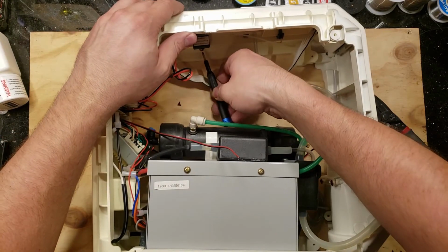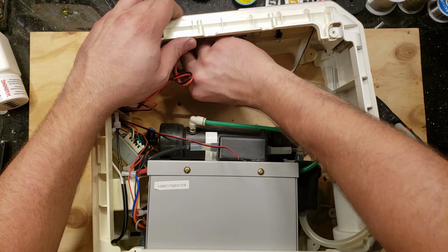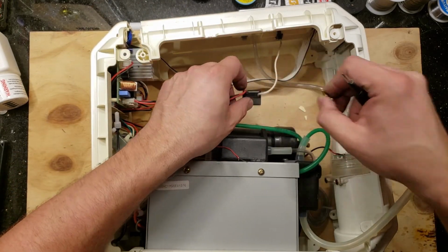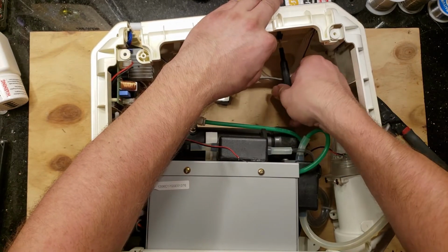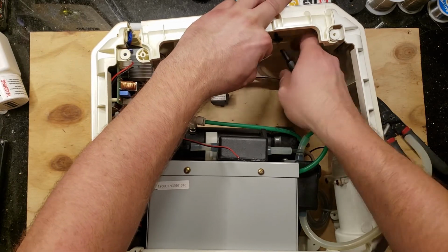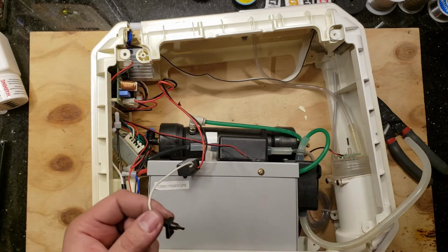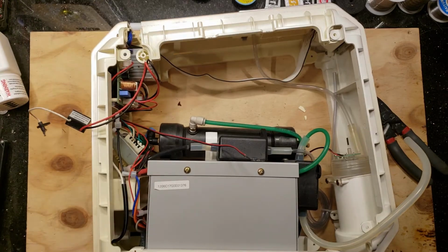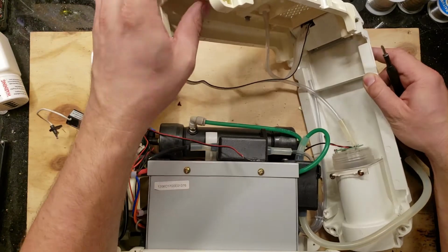Let's detach the anion generator. We'll test that piece separately. So I don't know what is the purpose of this. It's not generating ions into the stream of air. It's just generating them on the side of the case. So I don't get the point of this.